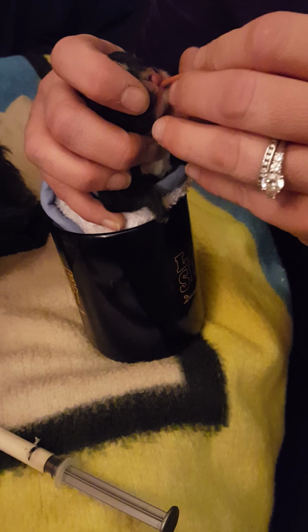So we hold the little puppy. It's okay, Jin. I know you want your baby back. You can have her back in a minute. So we're going to take this, and this goes down that far into the puppy's belly. Okay, open up, little one. And it's got to go on the left side. Let her give it a little.